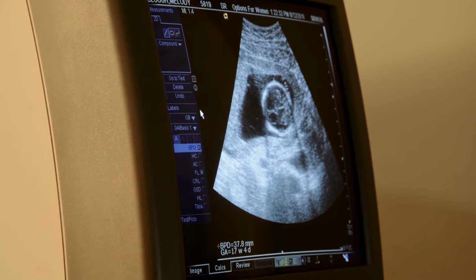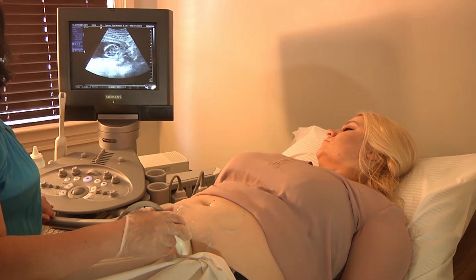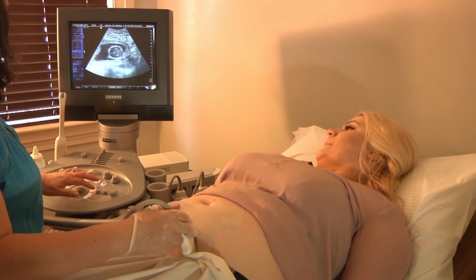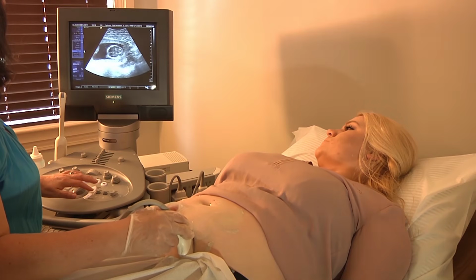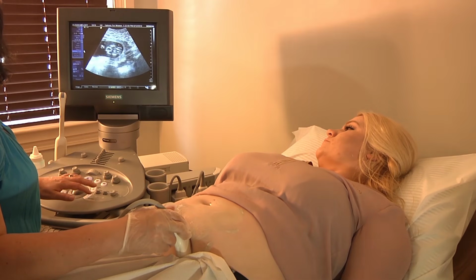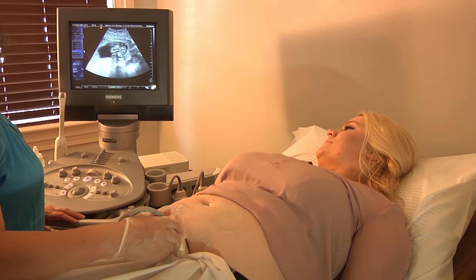I would go a little bit further. Maybe on that one. Okay, do you want me to undo it? Well, I think it was pretty good. I don't like that BPD. No. You've got too much of the eyes, so turn the other way. It's too late.